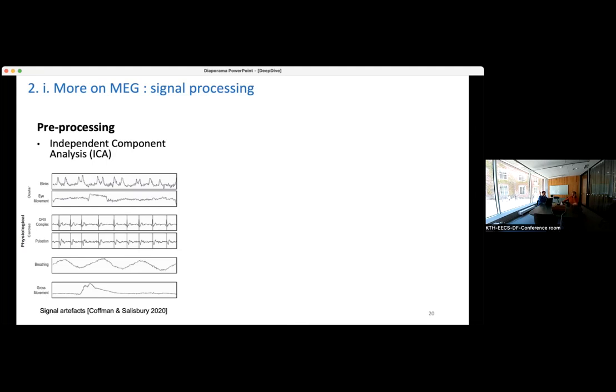What is the excitation? There are many protocols. I will not talk a lot about this, because the data that I use is called resting state. So we measure the brain of someone just sitting in this device that I just showed you. You're measuring noise, basically. Your brain is always operating. Whatever you connect to the system, there's always some signal, right? On average, you will have some kind of random excitation or random noise, really going nowhere. But if you want to see a reaction to something, you have to know what you measure with respect to something, right?